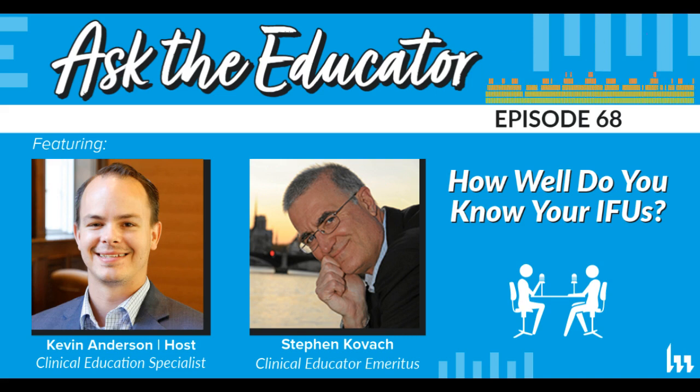Now, if they read a lot of the IFUs or even their washer times, it usually says minimum times. So you could have some that are 5 minutes, 8 minutes, 10 minutes. Are you going to set it and keep switching it? That's pretty hard. I think you can group items, or you find if something is 15 minutes, maybe that's how you make everything, because the one that says 5 minutes says minimum of 5 minutes. So maybe setting it at that one time, or that one outlier comes, that's where you change it, but everything else could be at 10 minutes. And so if it was 8, it gets 2 extra minutes, it's not going to hurt it.